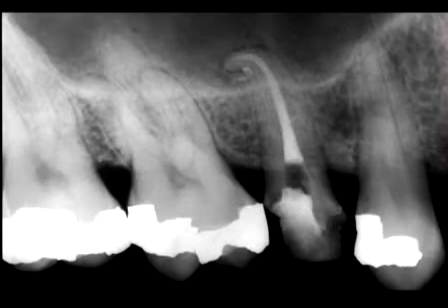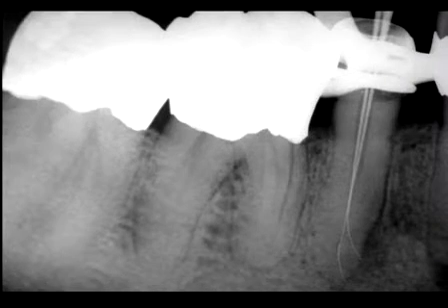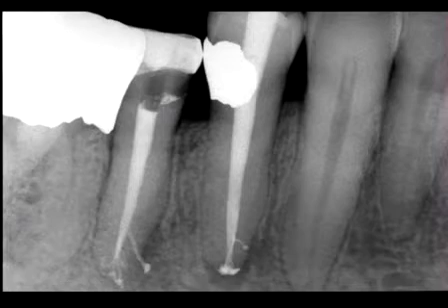The postoperative film demonstrates deep shape and that we fulfilled the mechanical objectives for cleaning and shaping. The working film of the mandibular bicuspid demonstrates the concepts we've been talking about. Working to the radiographic terminus allows irrigants to penetrate and circulate into all aspects of the root canal system. Fully shaped canals readily receive a non-standardized fully tapered master cone. Notice all the portals of exit that have been sealed.